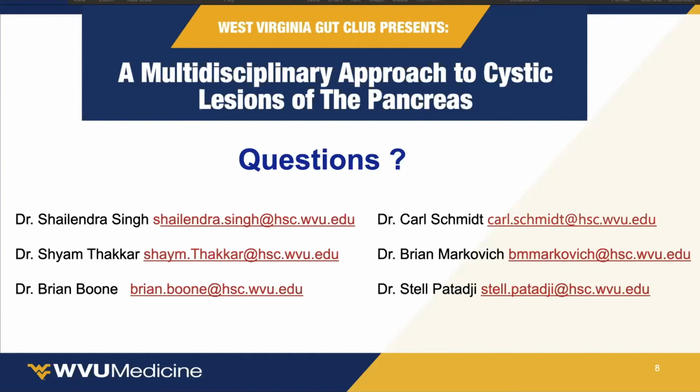Yeah, absolutely. From our perspective, MRI offers a number of huge advantages when assessing cystic masses of the pancreas, because MRI has a superior contrast resolution between soft tissue and fluid. Since many of these masses are of fluid signal or fluid content in some way, shape, or form, MRI does a much better job of not only delineating these masses, but also detecting cases where there are multifocal masses, such as in IPMNs, which we see quite commonly. Many of these smaller masses might not be picked up on CT.